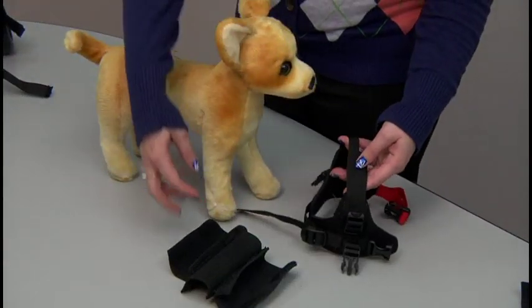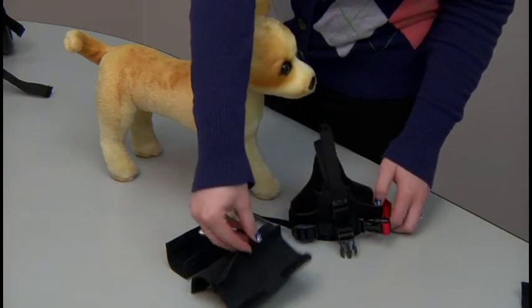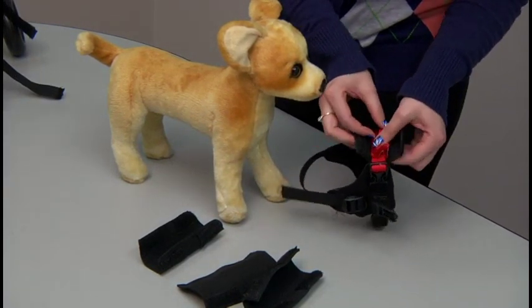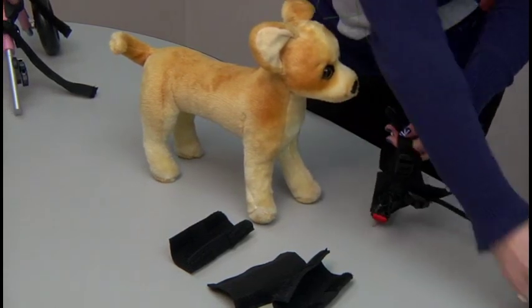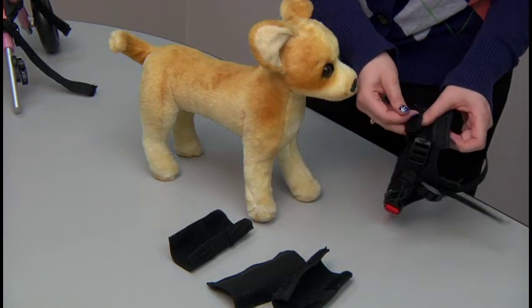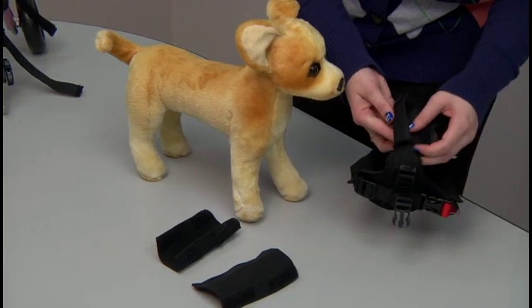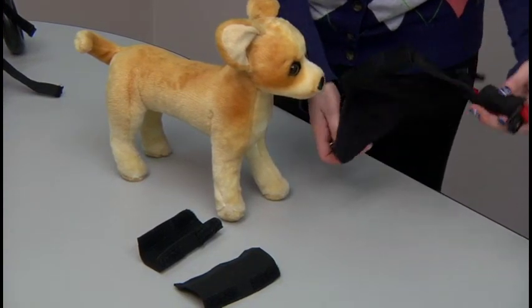Now we're going to put the comfort sleeves back on. For the shorter straps, you're going to want to have these comfort sleeves cut in half. Make sure that the comfort sleeves are tucking in the extra strapping so that it's not hanging down and interfering with your dog walking. Then simply put it back on the dog.